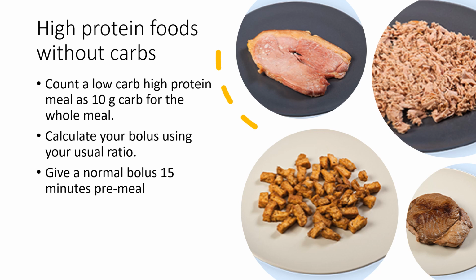Activities in the course guide follow-up section focus on the process for bolusing for high-fat and/or high-protein foods. The emphasis is on repeating the meal to confirm the effect, start low and build up, only change one thing at a time.